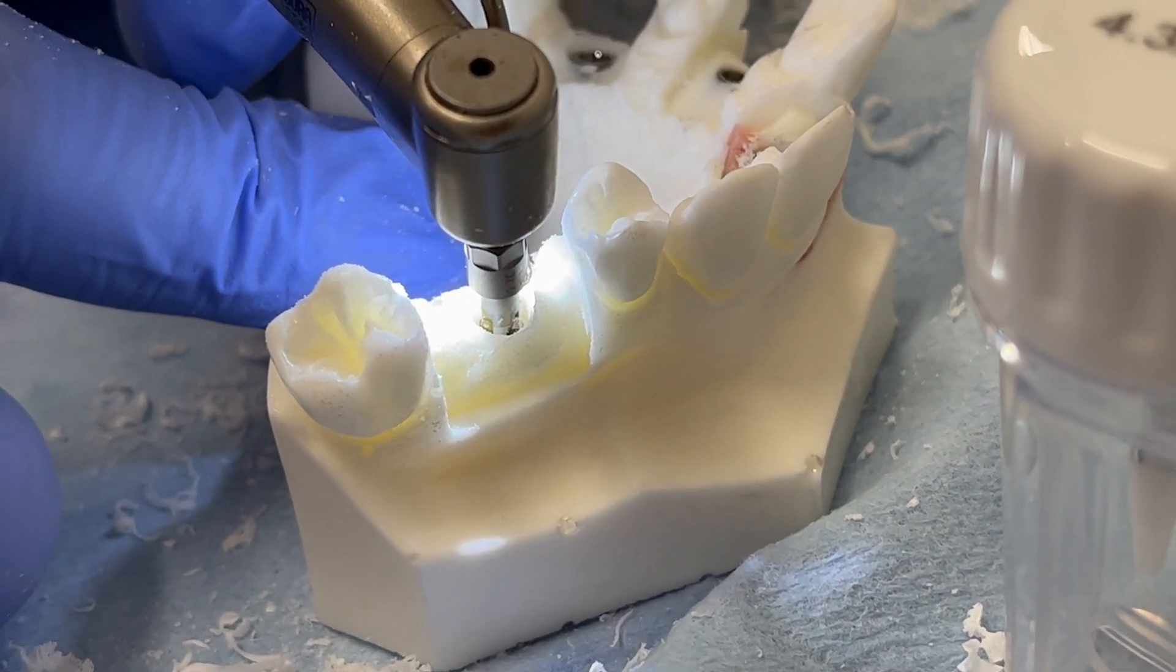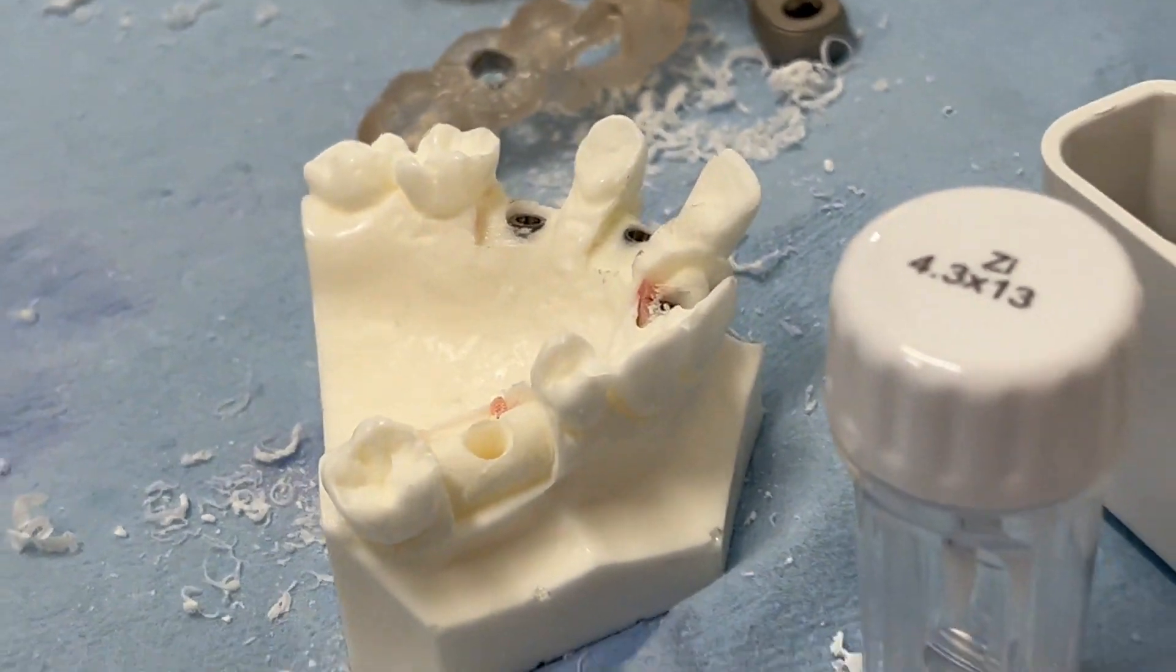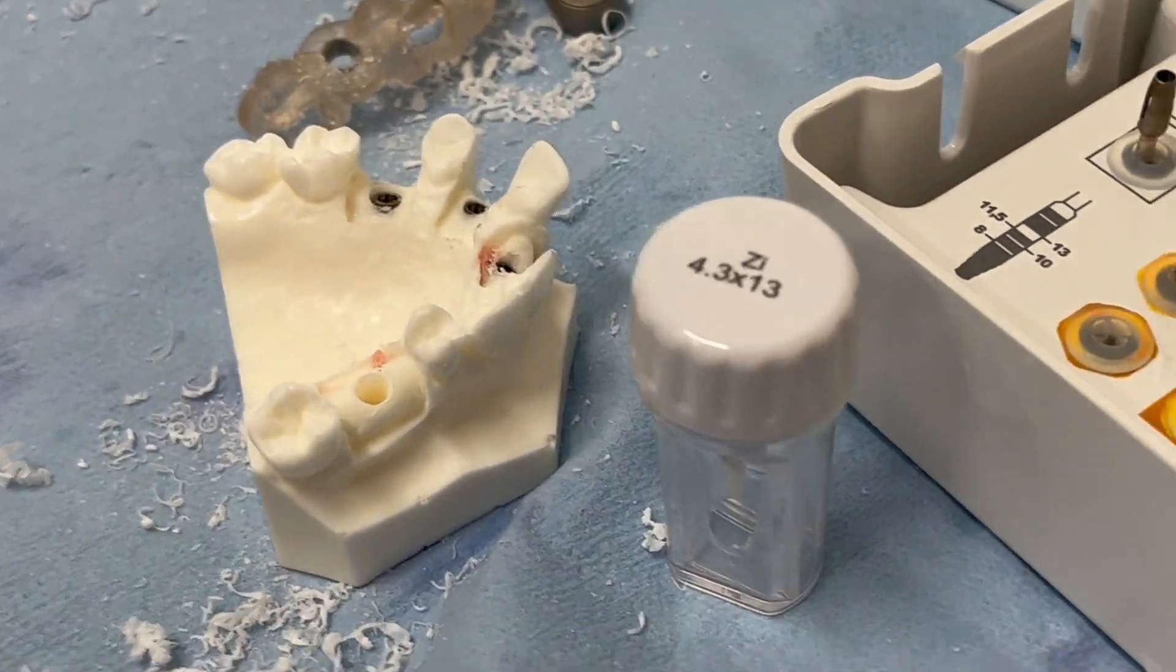And then we're going to just go backwards. We're going to turn this drill into reverse. And we're going to back this up, letting it do the work for you. So now we've threaded the inside of the osteotomy.